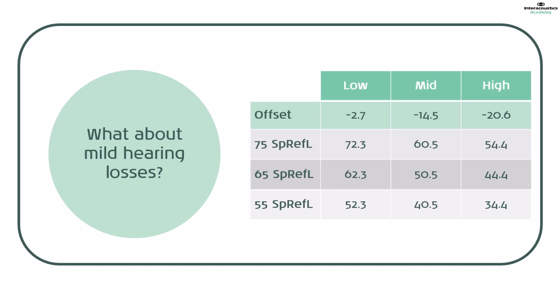One important patient cohort to give special consideration to is those with mild losses. In these cases, the main question is, might they be able to hear the sounds unaided? Because if so, they will definitely be able to hear the stimuli aided, and so there's minimal utility to performing the aided cortical test, as the results won't demonstrate any additional aided benefit over their unaided test results.